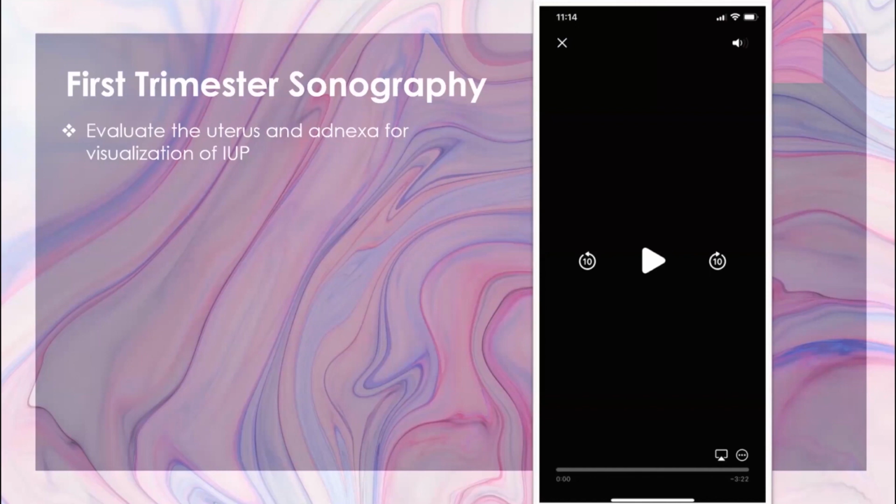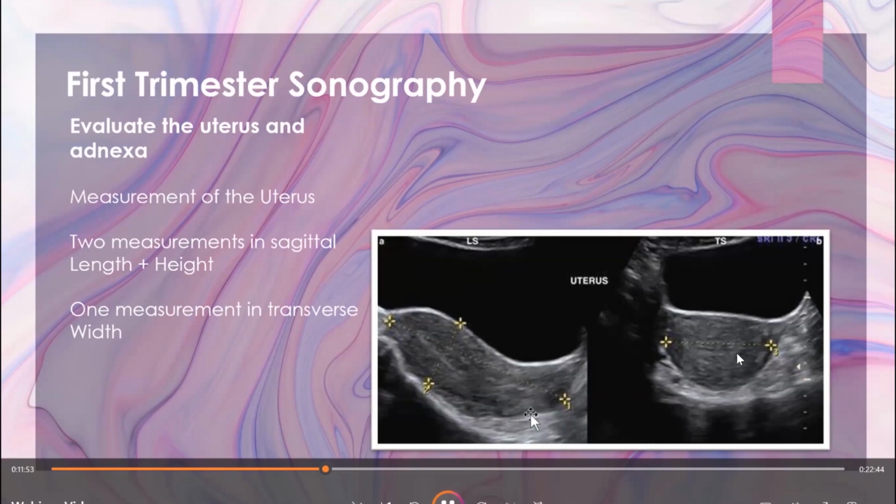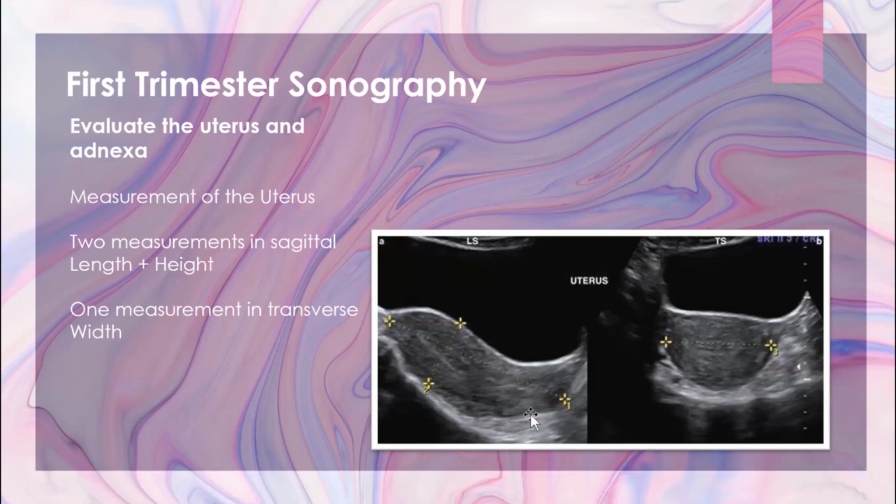And we'll go back to the PowerPoint. All right, so it's not a requirement for you to do measurements of the uterus, but it is common in first trimester sonography exams, so I just briefly touch on it. If you are going to measure the uterus, pregnant or not, you're just going to lengthen it out as much as possible. Some patients' uterus can kind of lean to the right or kind of angle towards the left. So you'll do some fishtailing to make sure you have the full length of the uterus, and then you'll apply calipers. So in your sagittal view, you see you have a nice bladder here.